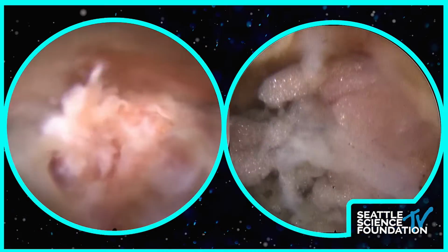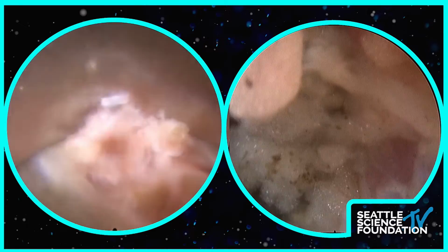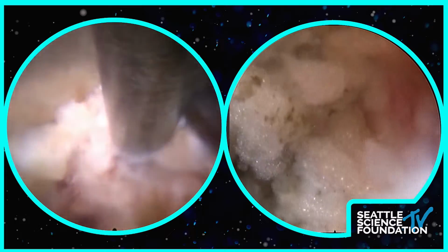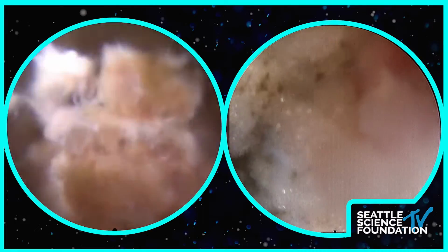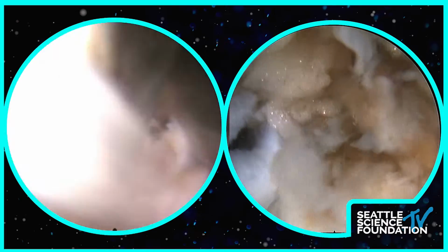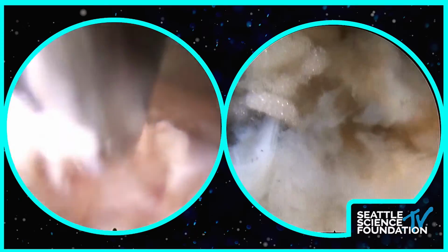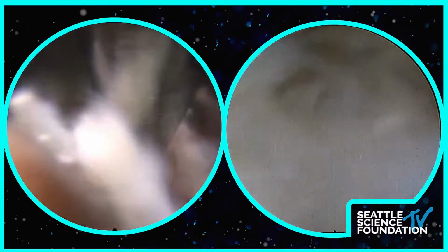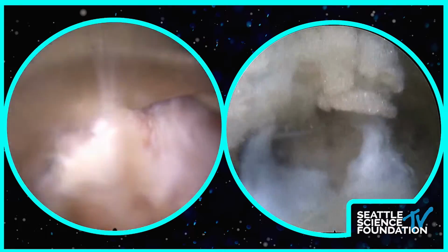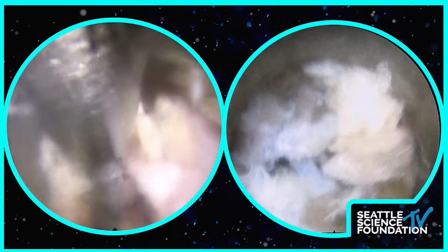Osama, you want to show us what Albert just mentioned? He just mentioned how he takes the cannula and goes across underneath the nerve root, kind of like retracting the nerve root, almost from a transforaminal angle. Oh, so like when you retract the traversing root? Yeah, similar to what John's doing, but you're doing it from a transforaminal axis. I guess if we go back to our exiting or traversing root here, there's our friend.